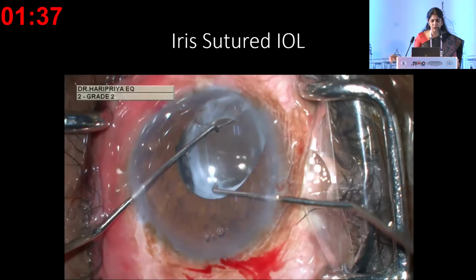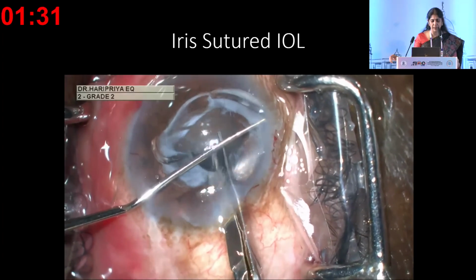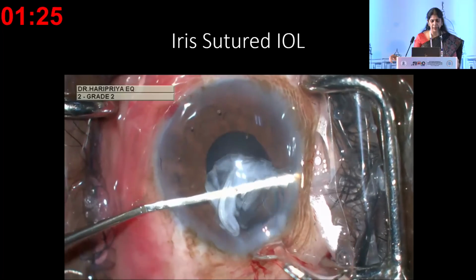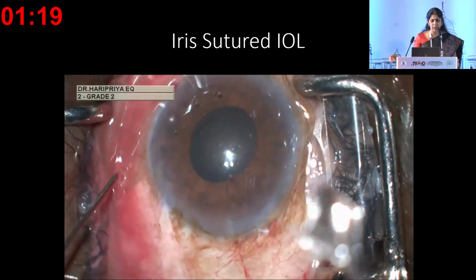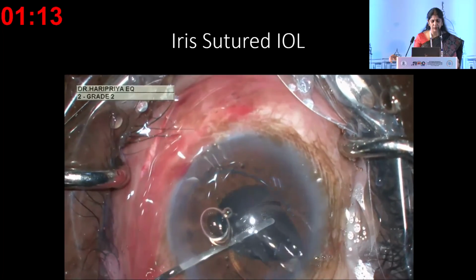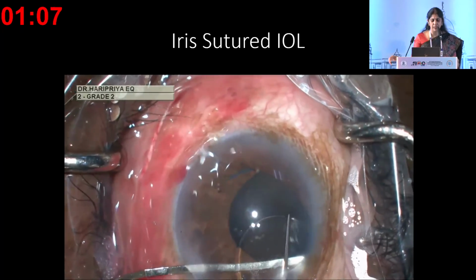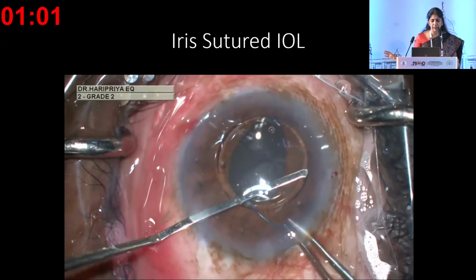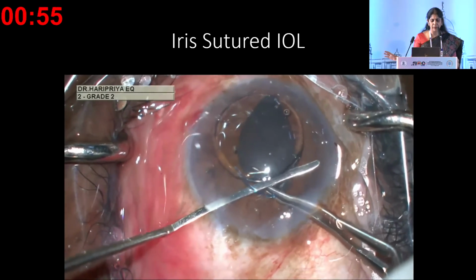I'll just show one variation of this technique of how one can consider doing an iris fixation with a 3-piece IOL. So this is a capsular bag and IOL which is completely contracted in a patient who had retinitis pigmentosa. So through a 3 millimeter incision, the IOL is cut, and then a new 3-piece acrylic IOL is first placed in the anterior chamber. So this is a sensor IOL. I like a sensor in these cases because the anterior surface is rounded. So I'll only tilt the leading haptic behind the iris, have the optic in the anterior chamber, supported from below using a cyclodialysis spatula, and tuck the trailing haptic below the iris.